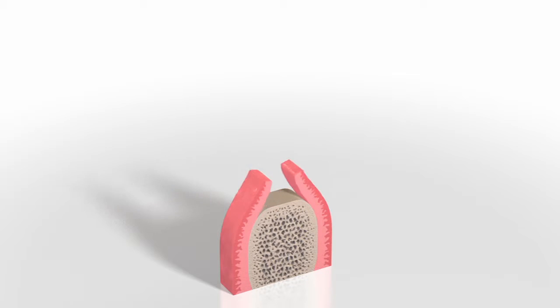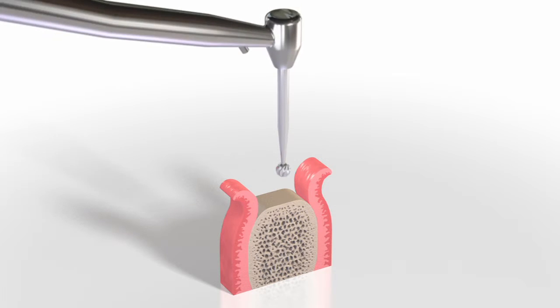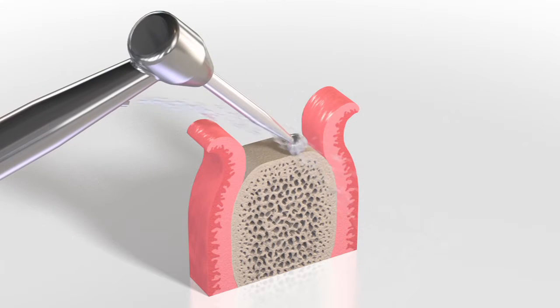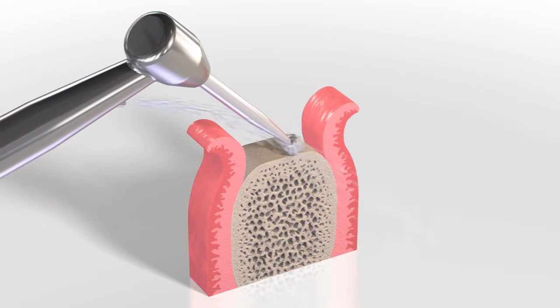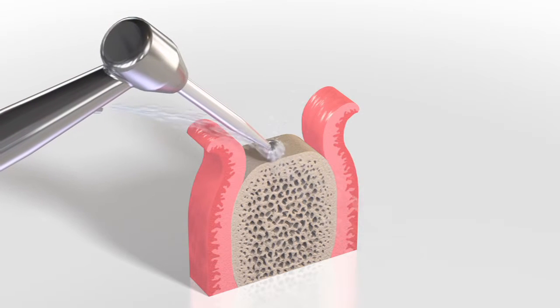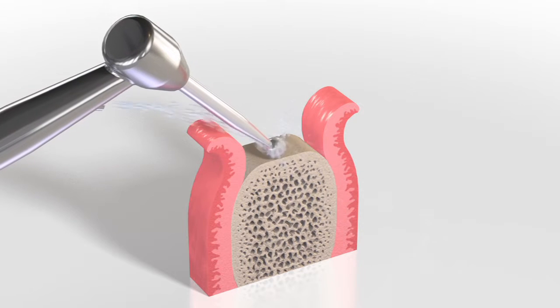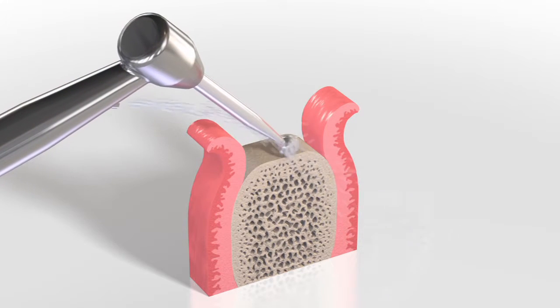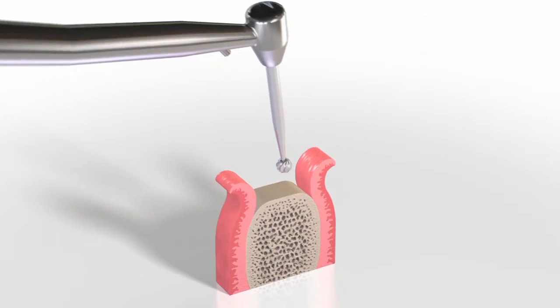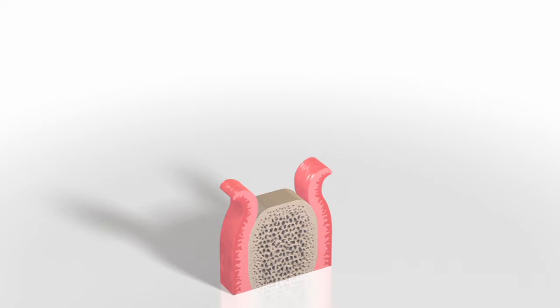After opening the gingiva, the basic implant bed preparation begins by carefully reducing and smoothing a narrow tapering ridge with a large round burr at a maximum speed of 800 RPM. The goal is to provide a flat bone surface with a sufficiently wide area of bone. When choosing the implant length, the vertical dimension of the bone has to be considered.